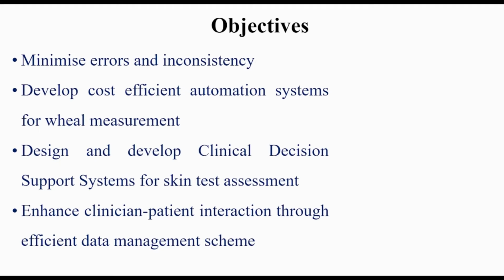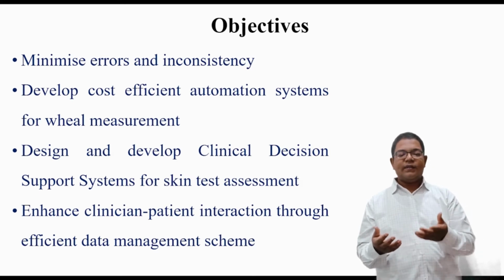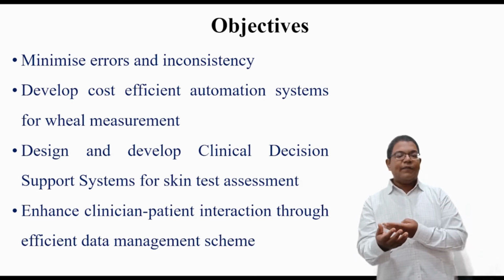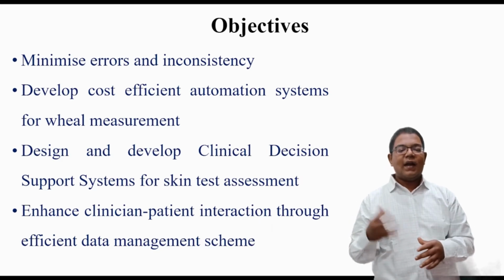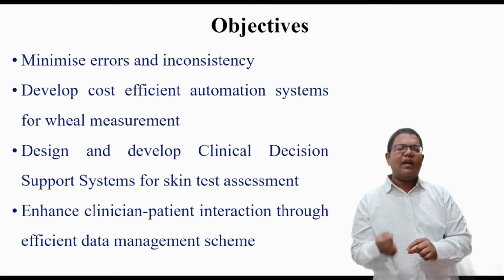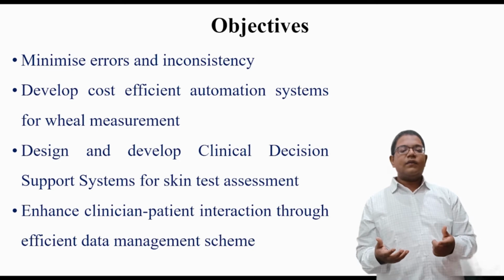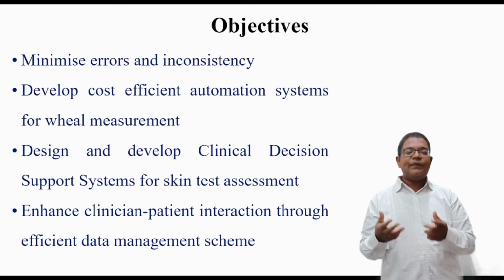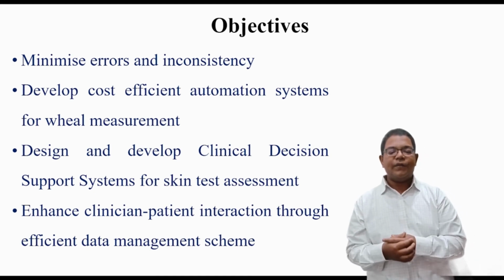From the image processing part, what happens now? This is the basic medical photography part, and first of all, it is medical photography, not medical imaging. Medical photography is the use of edge devices and mobiles for taking photographs. Of course, we have very high-end sophisticated systems, 3D cameras, images and scanning systems, for measuring the induration of the wheal very accurately, but they are really costly. And again, the patient has to come to the lab to avail those services. So our task is to ensure that the use of this test is not underutilized by the patient being absent from reporting for the test.